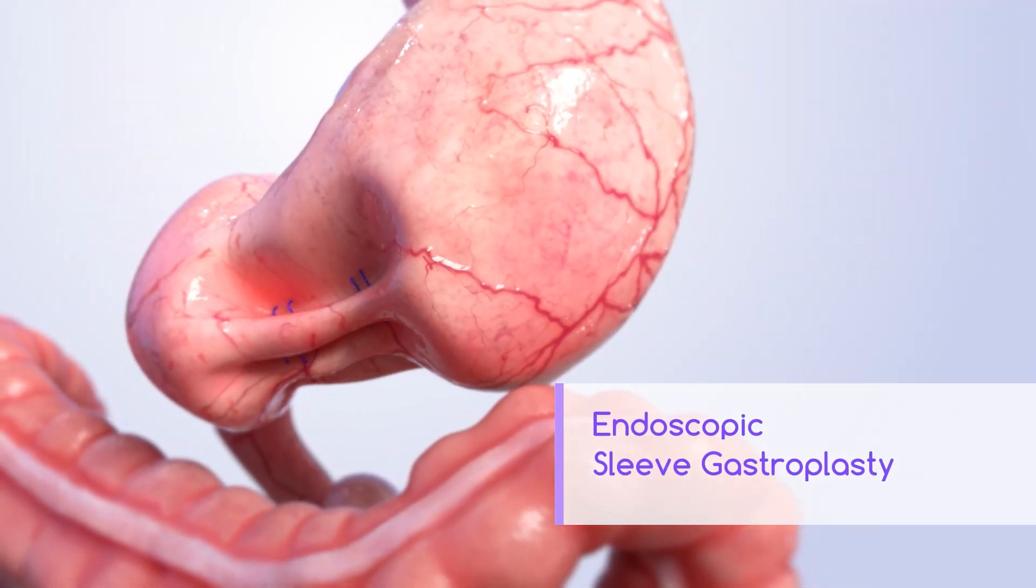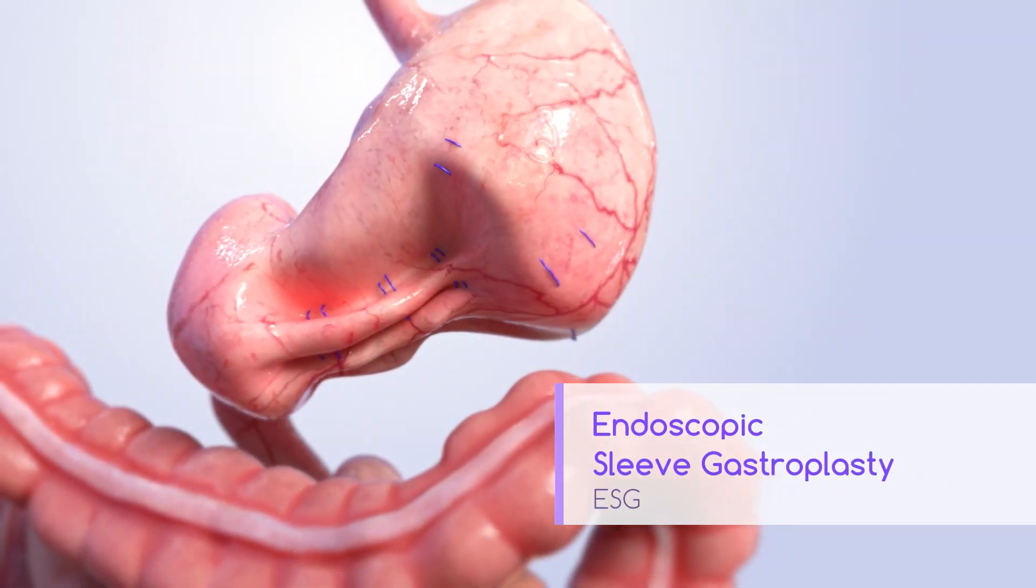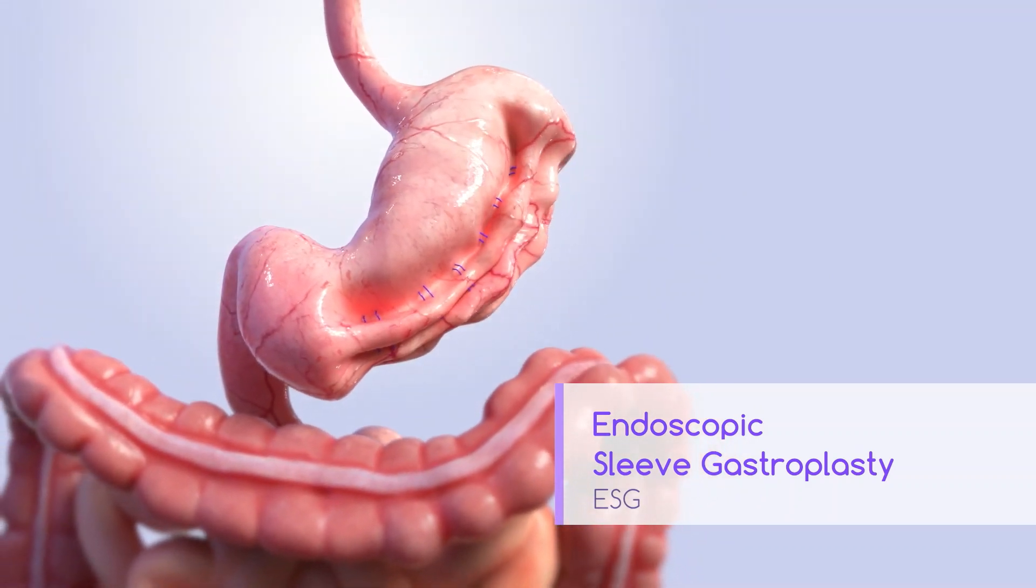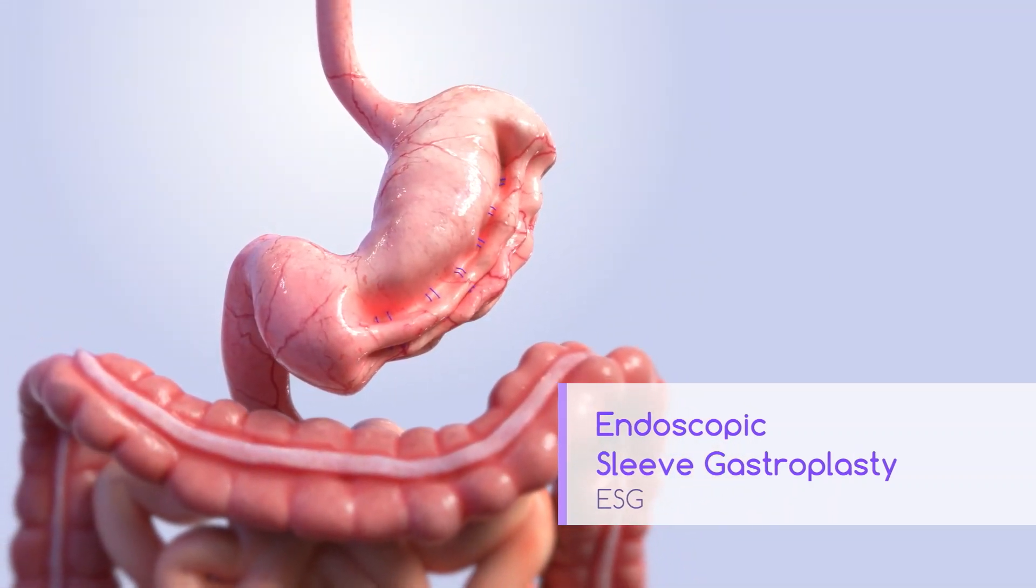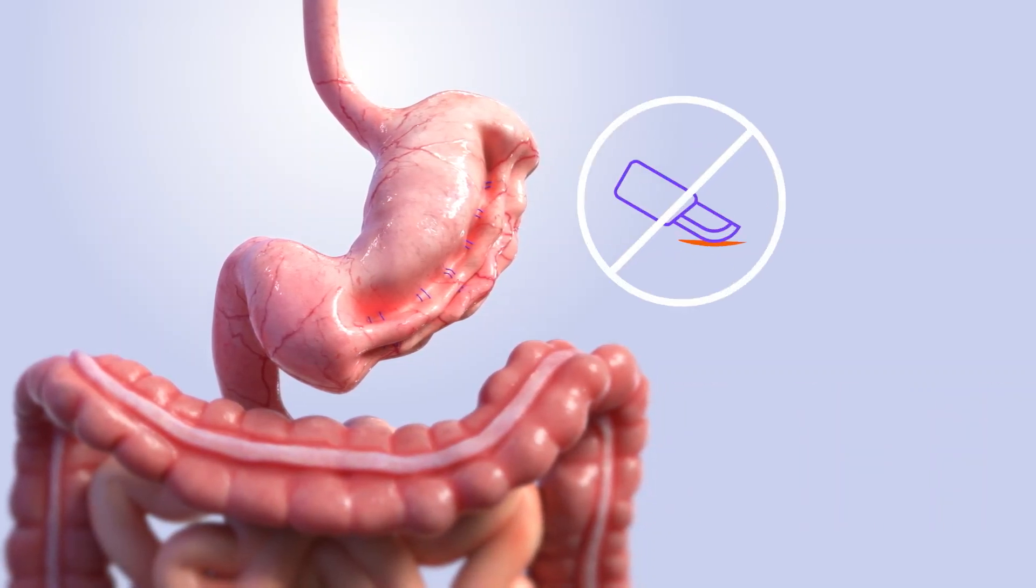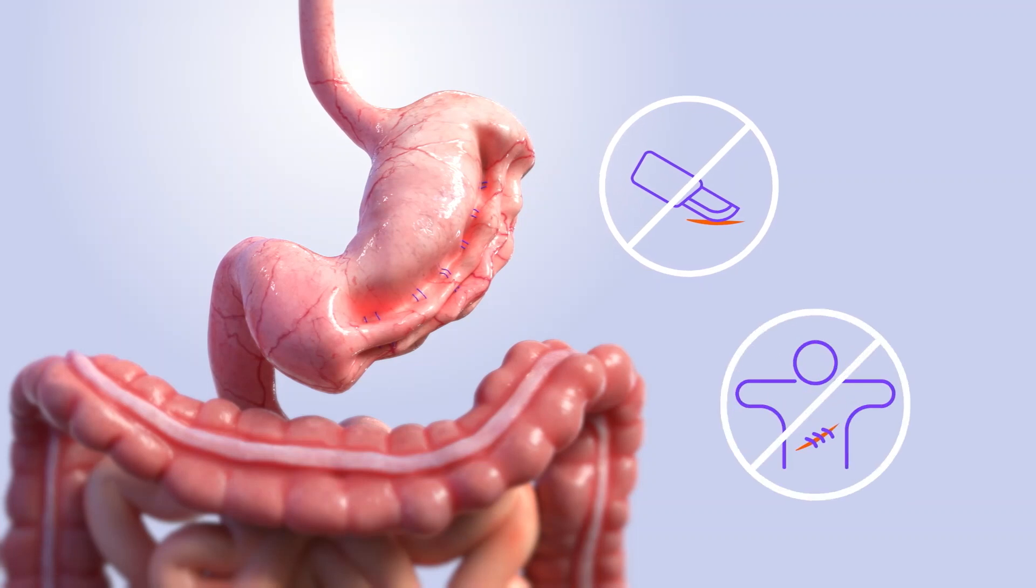Endoscopic Sleeve Gastroplasty or ESG is a weight loss procedure that reduces the size of your stomach so you eat less and feel full faster. It's performed by a specially trained doctor endoscopically, which means no incisions or scars.